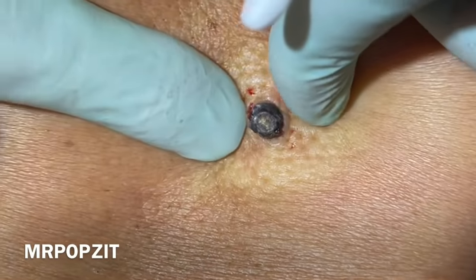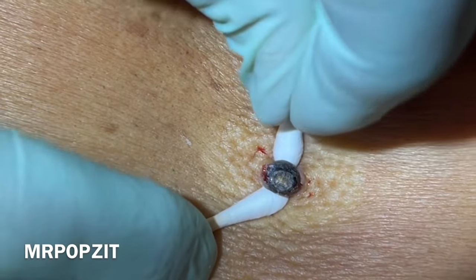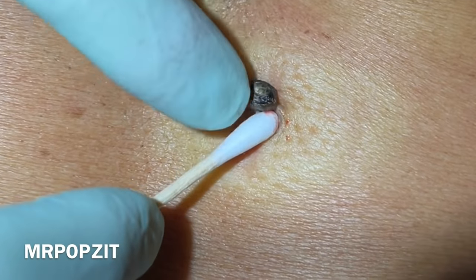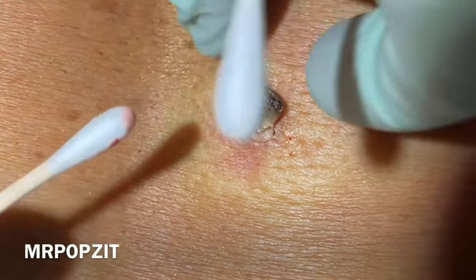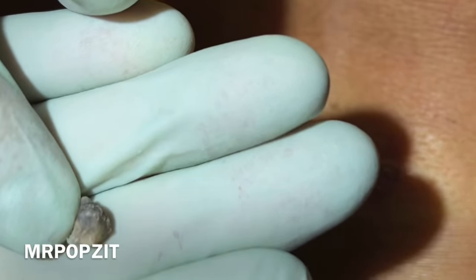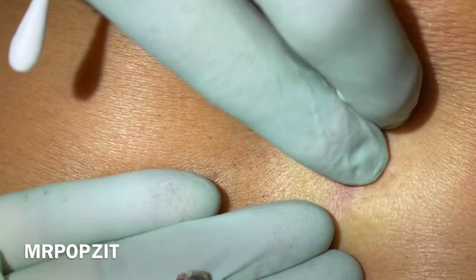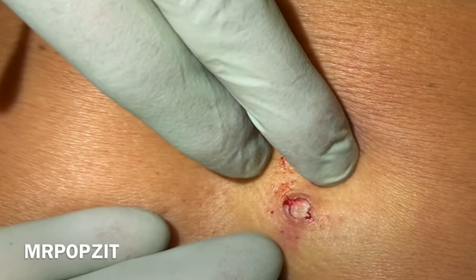That's coming out nice. Shouldn't have any pain. You can kind of see that dried up contents there — that's just the top of a cyst here basically. You can see that as it goes down you can kind of see the little cyst particles and it gets mushy and soft. Now I'm going to curette this out and scrape it, and then most likely we'll just do some cautery and that will kind of tighten that up into a little scab.